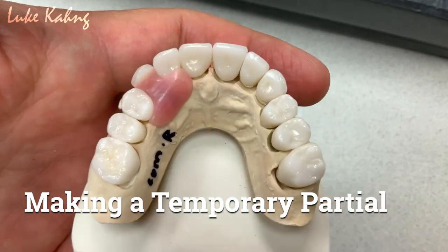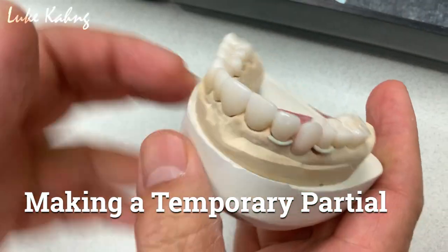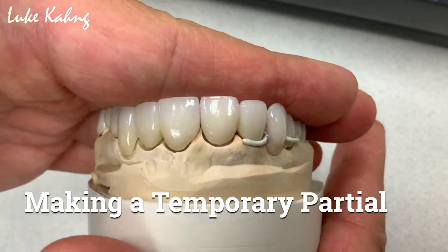Okay, so this is all monolithic. But here are the facials. We finish them up to final work.